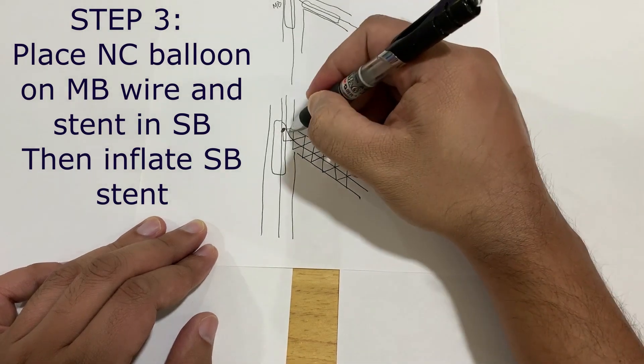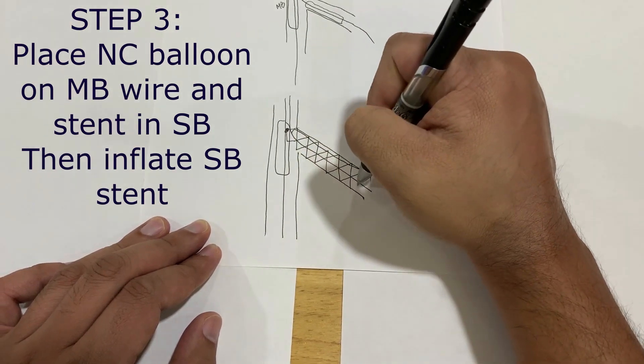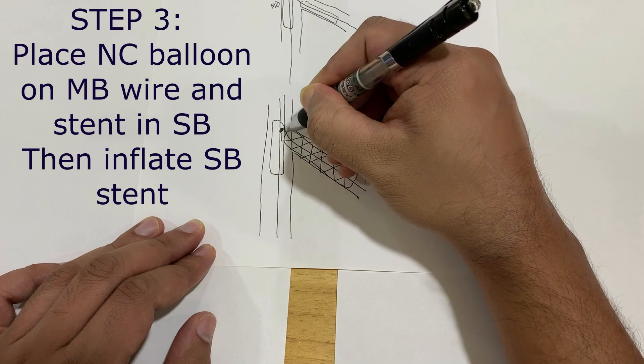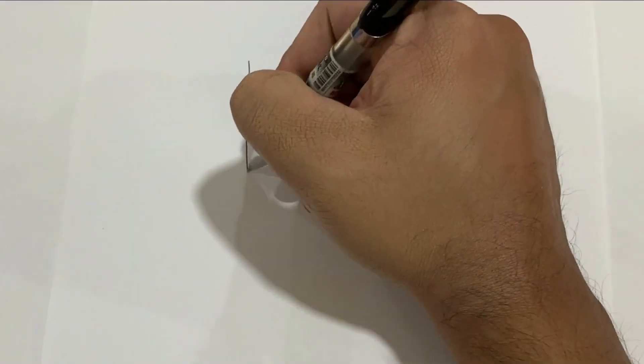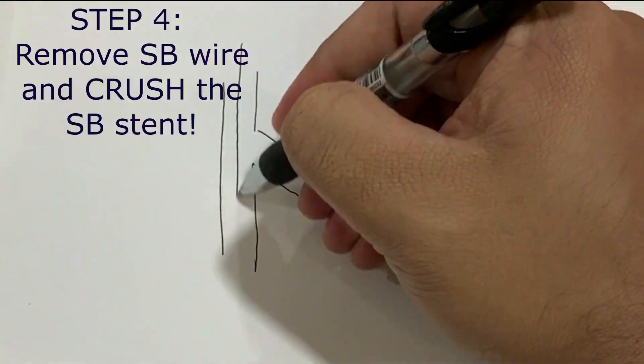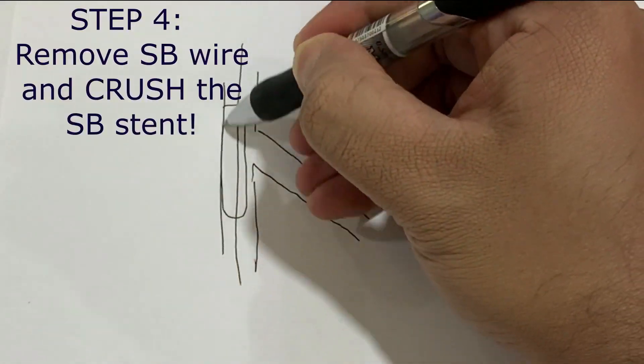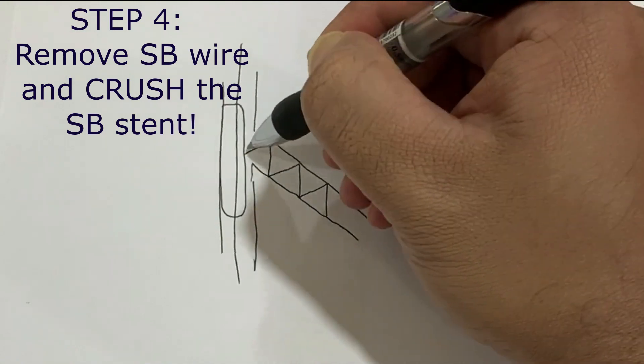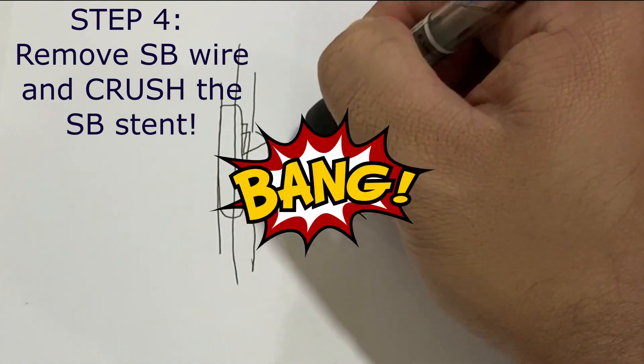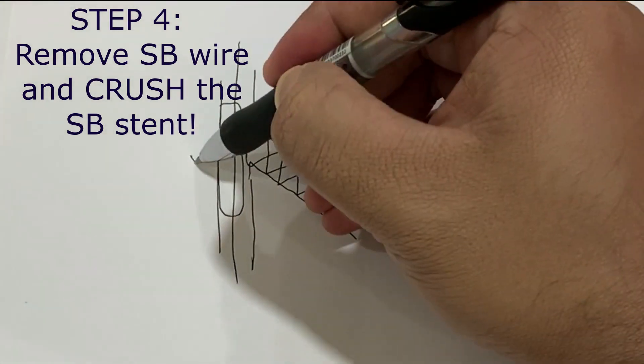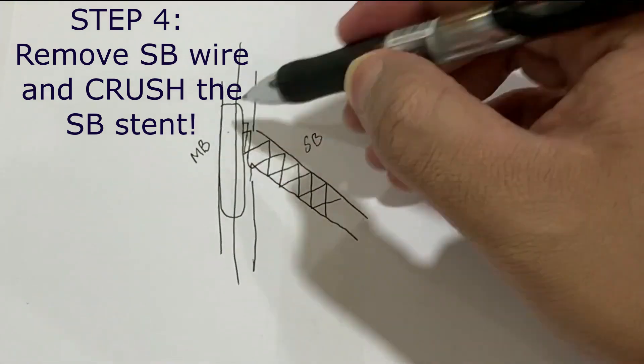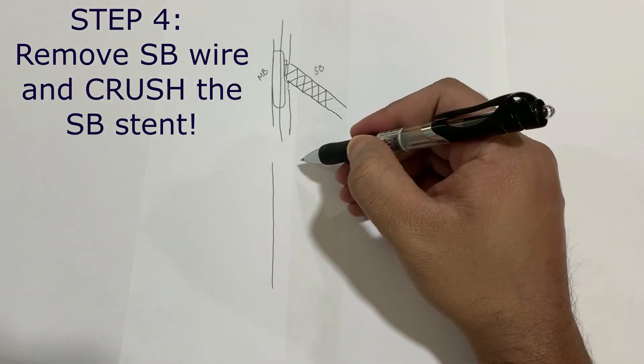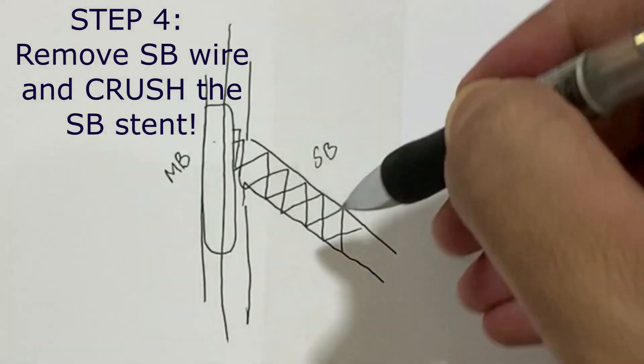Next step is to dilate this with the stent balloon. After the stent is deployed, you inflate the main branch balloon to crush this side.